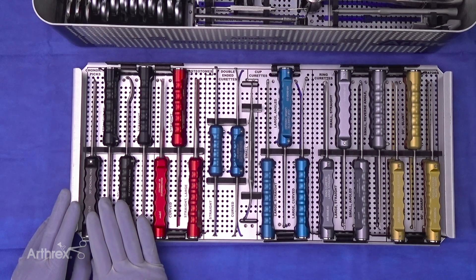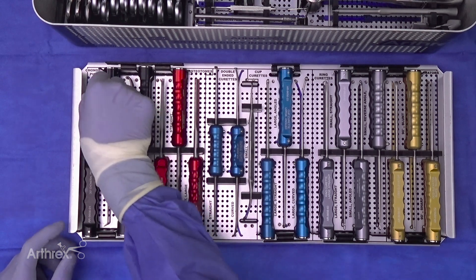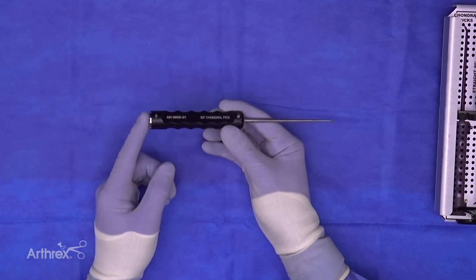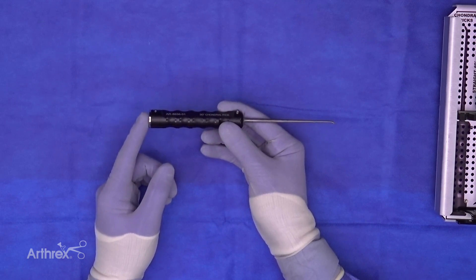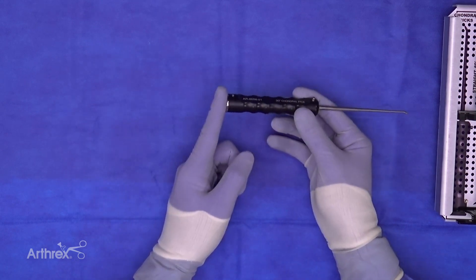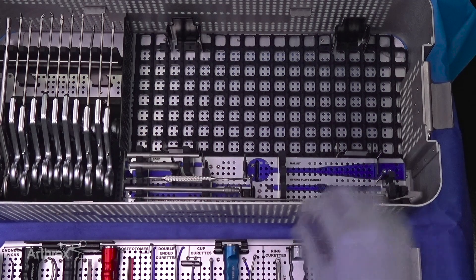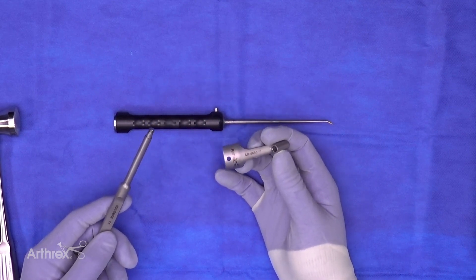We have a new specialized way of impacting the chondral pics so the instrument doesn't skive. The surgeon can impact the back of this 30-degree chondral pic with a mallet, but historically since the chondral pic is at a 30-degree angle, when you hit it with the mallet it tends to skive forward rather than into the bone. So we've created a specialized strike plate that attaches to the chondral pic.